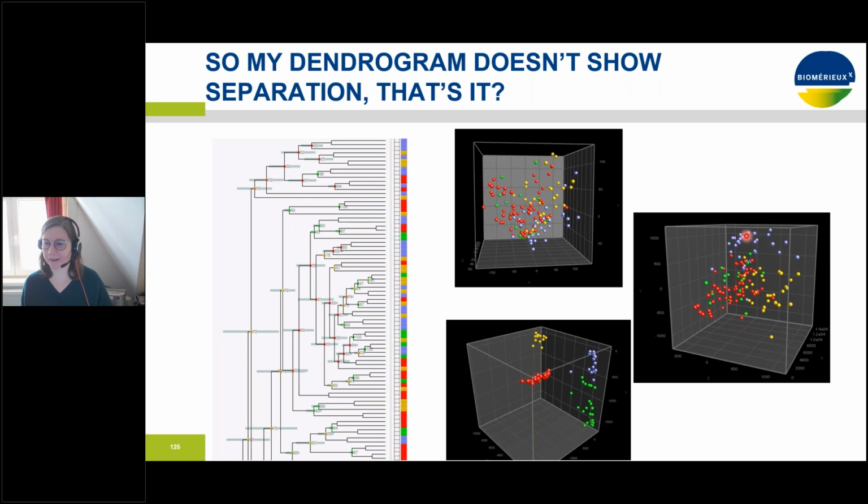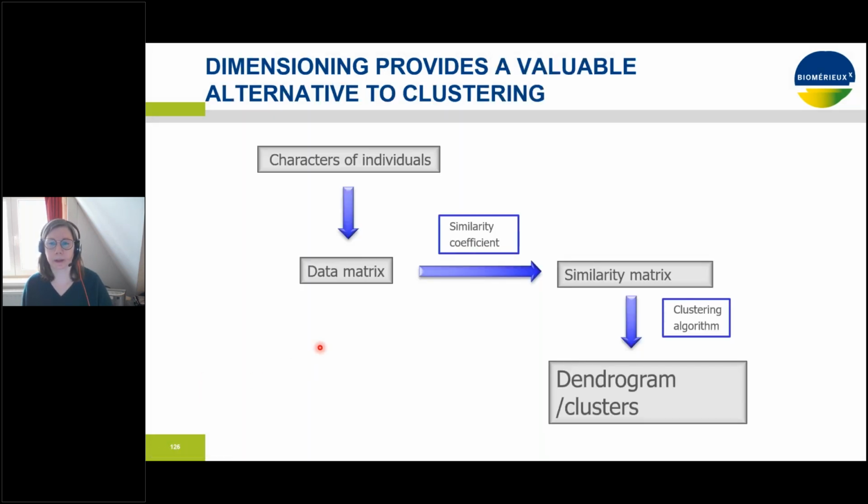So here we can see that the blue group is relatively well separated. The yellow group has some mix between the yellow and the red. And then here, the red and the green group. I apologize for those who are color blind. You won't be able to see it, but there's no distinction. So the yellow, the red and the green group, they're completely mixed. So in this case, if we would proceed with trying to predict these groups, we would probably just put the red and the green group as one group, saying it's either red or green, and not specify the specific color. So once you see that, you can continue with your linear discriminant analysis.